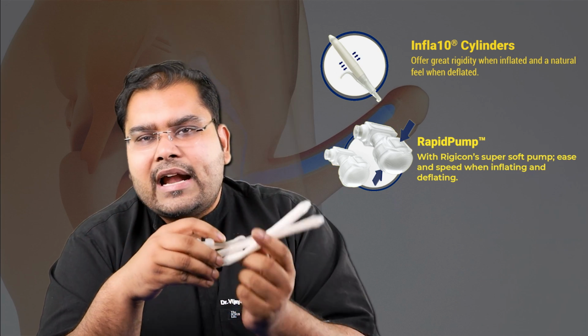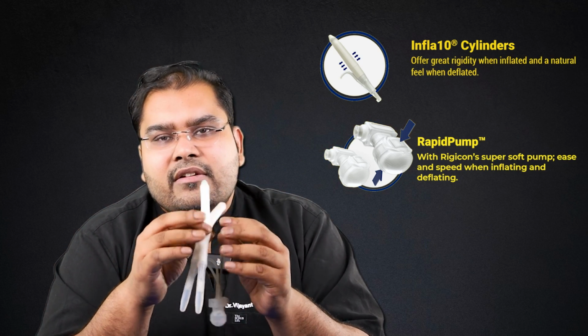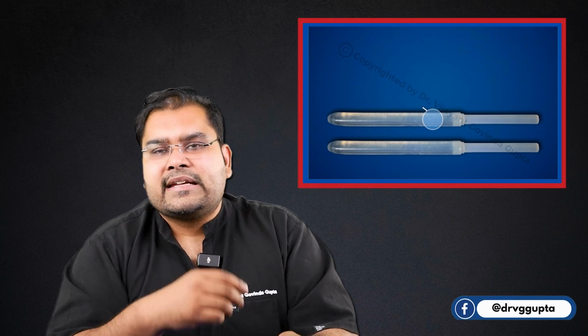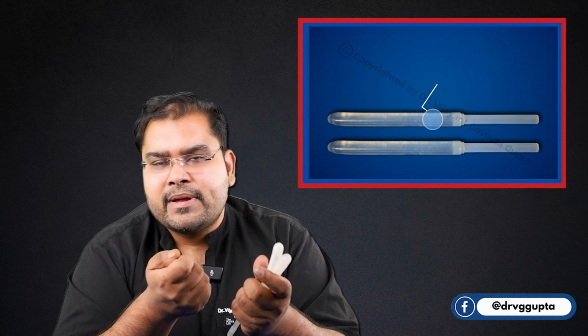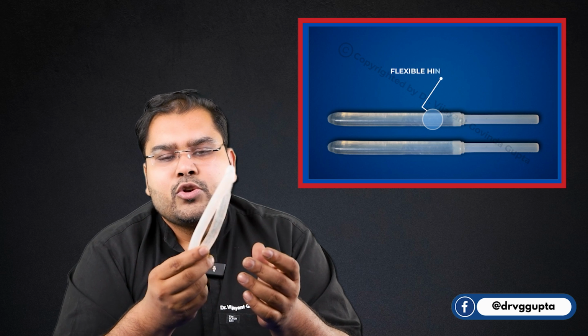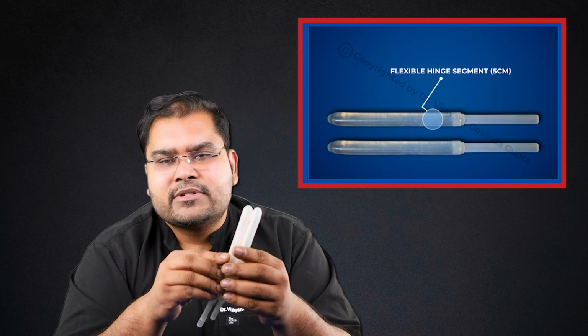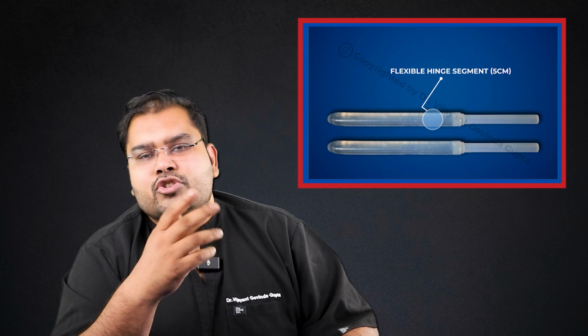So if you want something very similar to a natural erection, that is, you don't want to be semi-hard all the time, you want the implant to completely disappear and become completely concealed, and you want to get fully hard on demand, then this implant is for you. But if you want something which is technically easy, does not require too much pumping, has no mechanical parts, you want to be hard, but you are fine with being semi-soft most times, then the Indian implant could be a good choice.